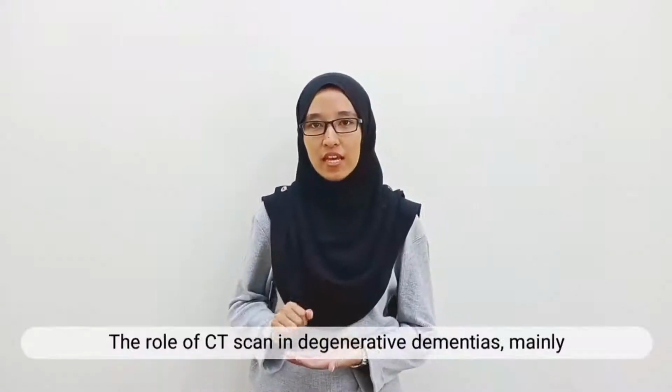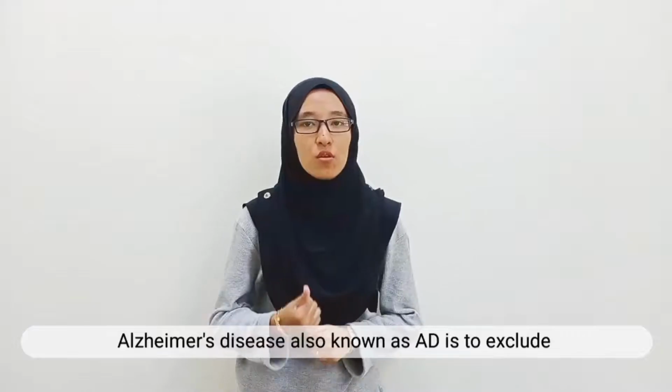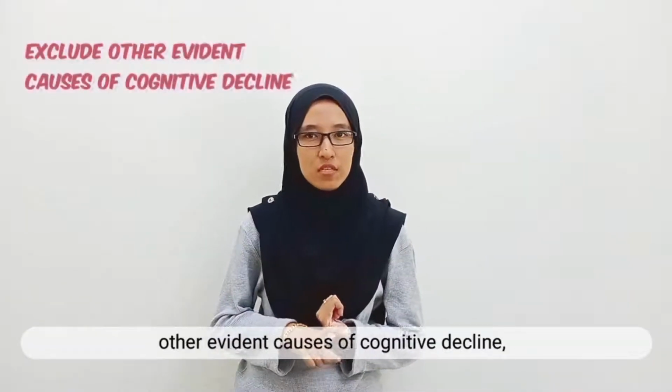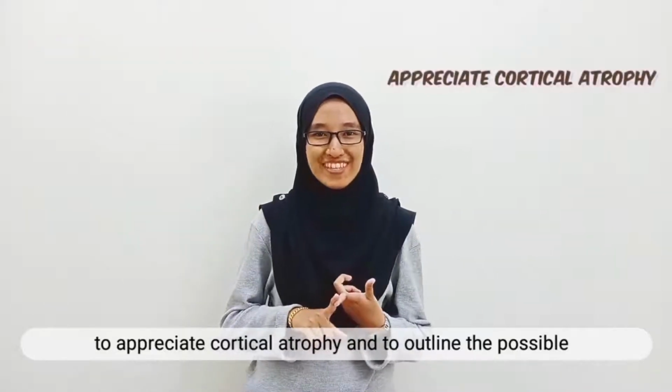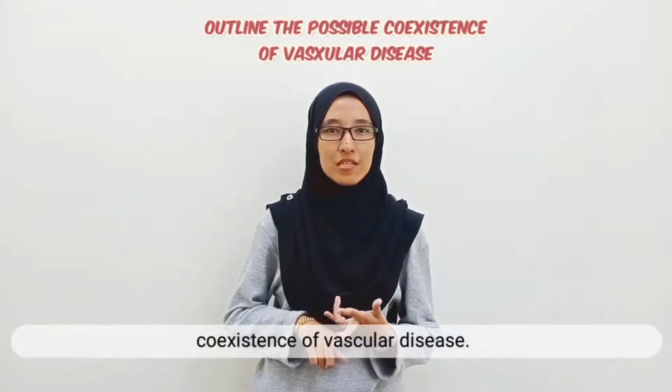The role of the CT scan in degenerative dementias, mainly Alzheimer's disease, also known as AD, is to exclude other evident causes of cognitive decline, to appreciate cortical atrophy, and to outline the possible coexistence of vascular disease.